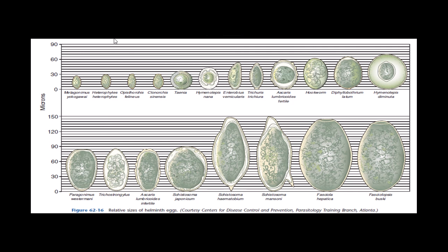So in parasitology, in order to make the diagnosis of a worm, it's extremely important to look for the ova or the egg.